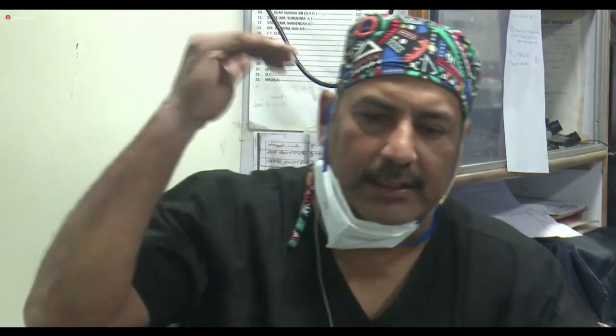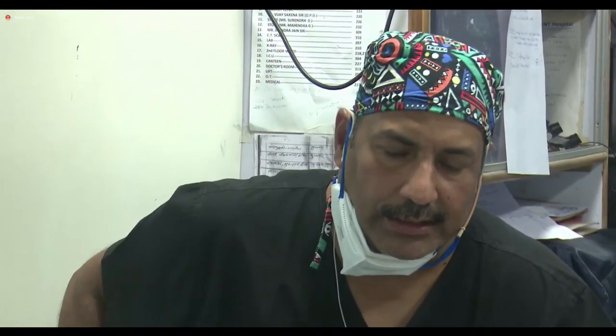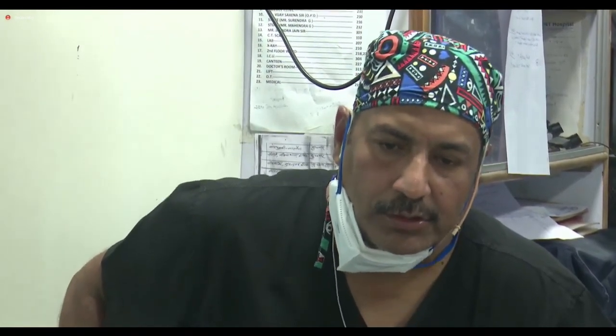We go above the level of the common canaliculus to the dome of the sac, which is almost 5 to 8 millimeters above the level of the common canaliculus. So right from there till the nasolacrimal duct below, we marsupialize the entire nasolacrimal system on both sides like an open book. You don't leave any raw area, and it doesn't direct you to use all those canalicular stents or all those things. Reserved for revisions only. Very, very rarely.